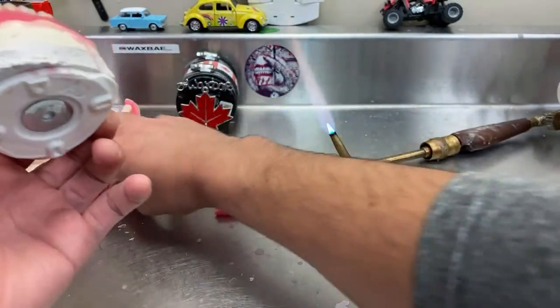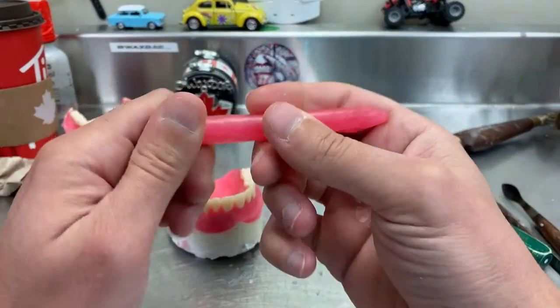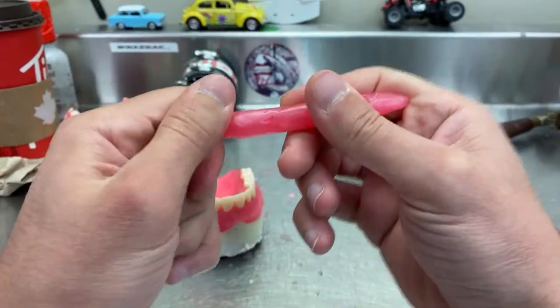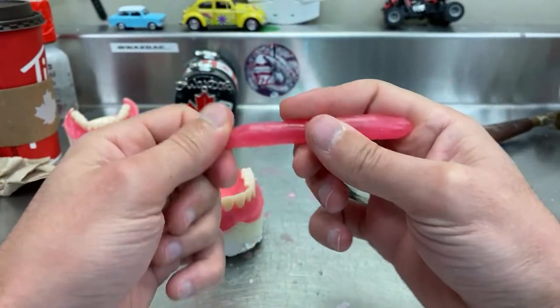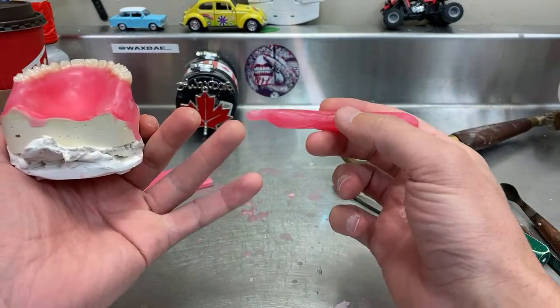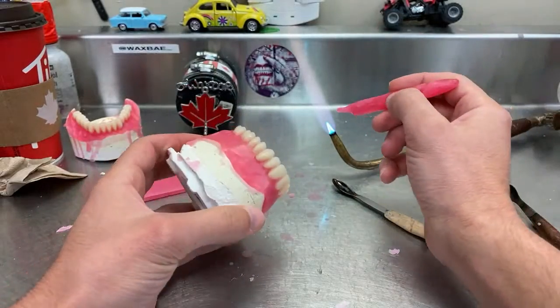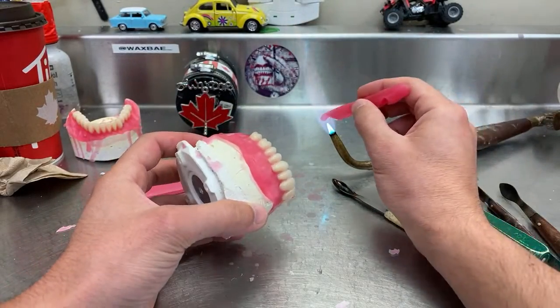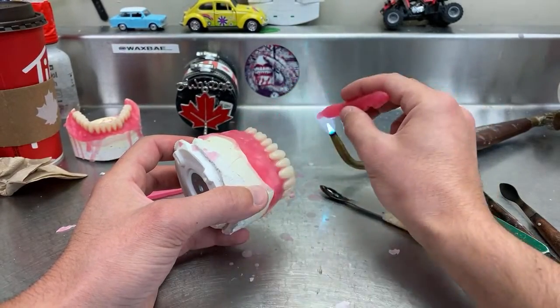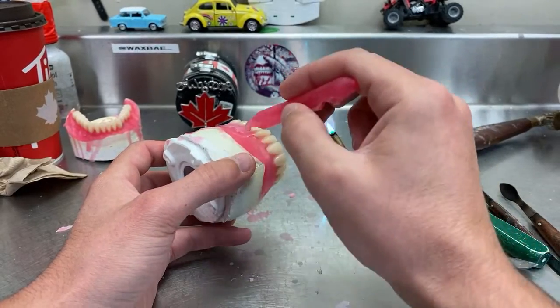And since in the lab everything must move so fast, what I do is this, make a point to it right here, and then I just go and add wax here because I don't have to worry about this melting the old wax. So here's what I'm gonna do. I feel like it's faster to do it that way, actually.